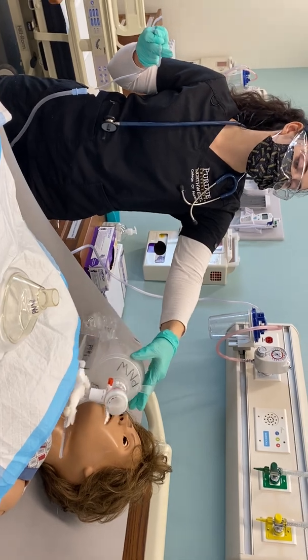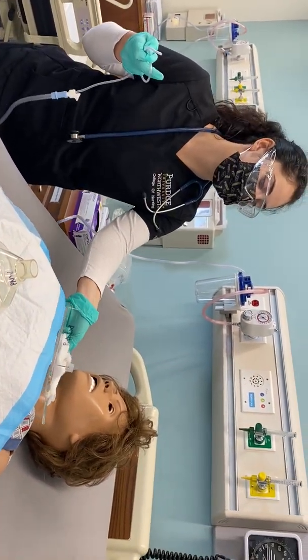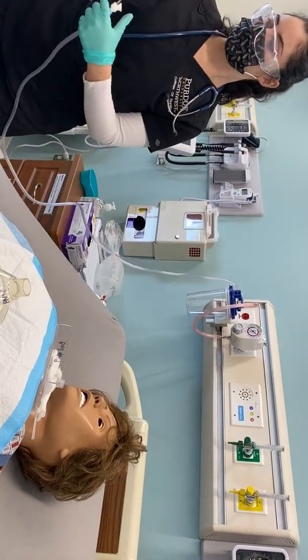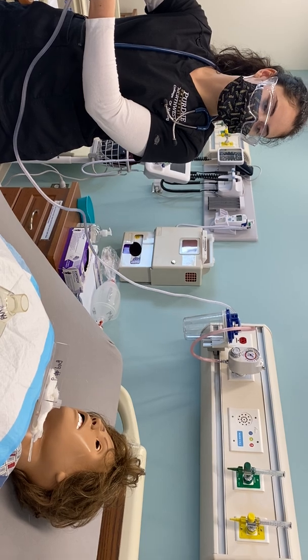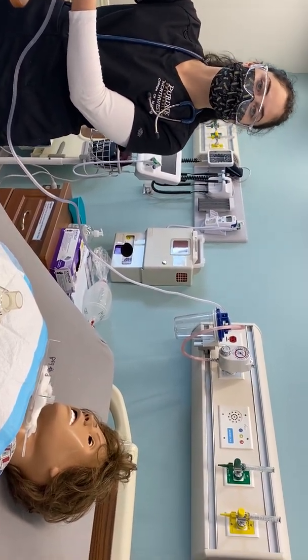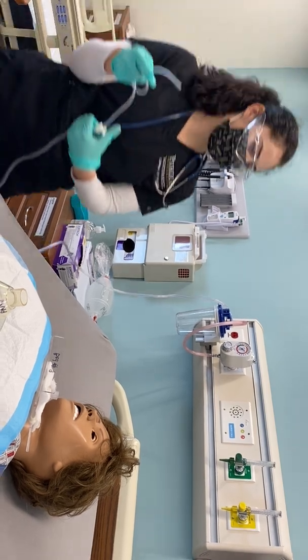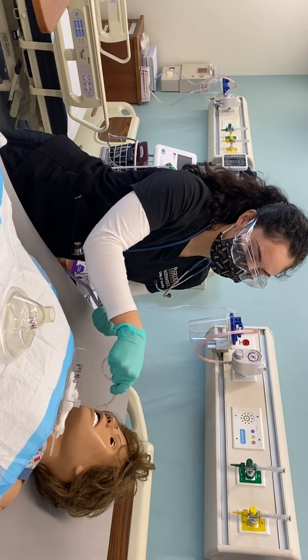Okay, I would do that slower in a real situation. I wouldn't actually touch this in a real situation, I'm just fixing it. Now that I've done that, I'm just going to clean it out. Mr. Jackson, do you feel like everything's a little bit more clear? If it wasn't, we would be doing this repetitively in the same act that I just did it. For now, I'm also just going to clean out your mouth for any mucus.